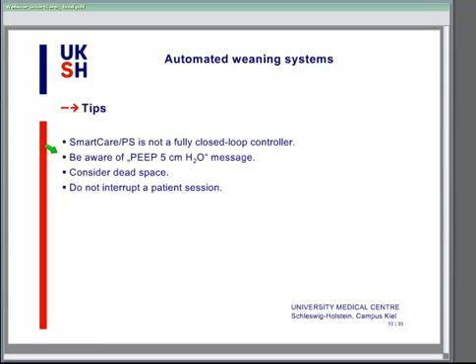And I think when you perform a clinical round and your patient is on SmartCare, you also have to look into the system. There is a special SmartCare view defined on the ventilators where you can follow up the pressure support levels, for example, and also the diagnosis and the therapies that are evaluated by the system. I think this must be a part of the clinical round to understand the system and to get a clinical view of the patient by the system.